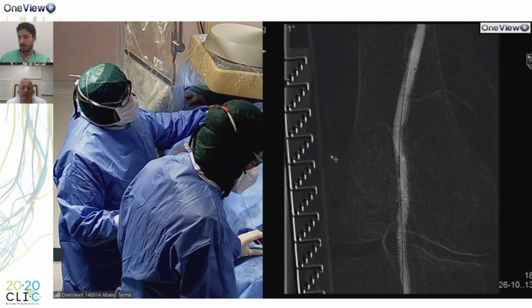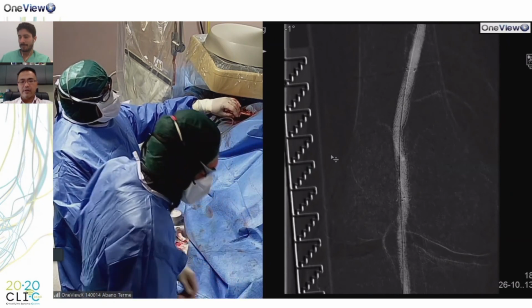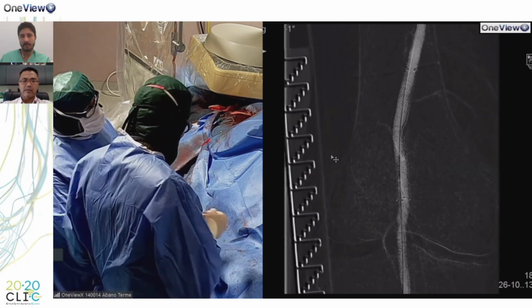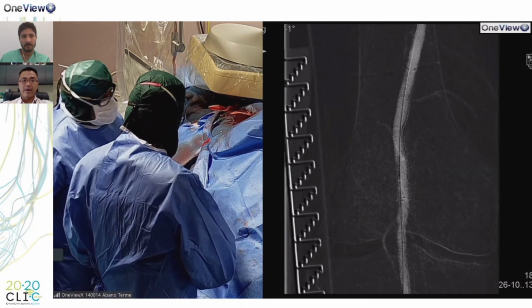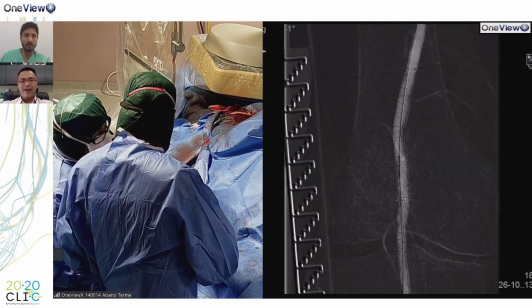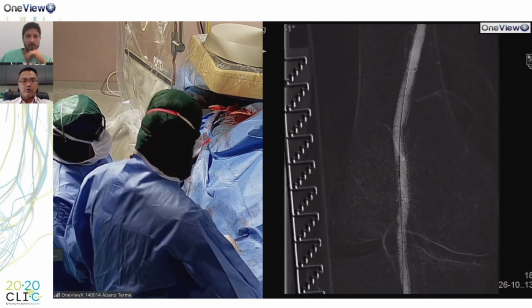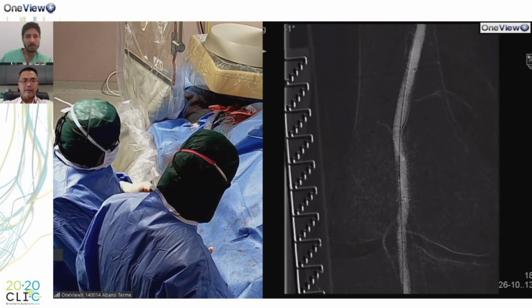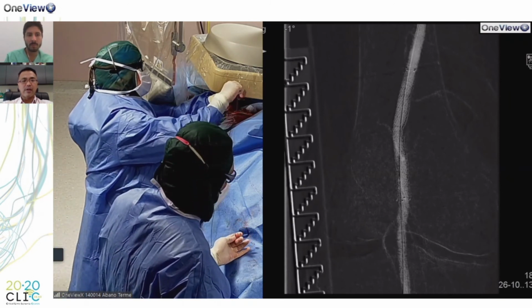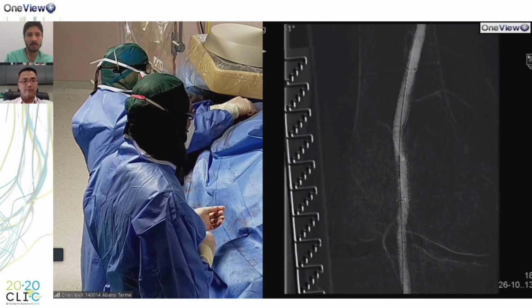Perfect. So there are several papers on the use of IVUS post-stenting that show that if you have a minimal luminal area of more than 15.5 square millimeters, it is perhaps associated with a better patency at 6 months. This is a Japanese study. So 15.5 square millimeters becomes a 5 millimeter lumen. And Mariano, you would know from your experience with the Supera that the data seems to suggest that if you implant a 5 millimeter Supera, the patency is much better than maybe a 4.5 or 4.